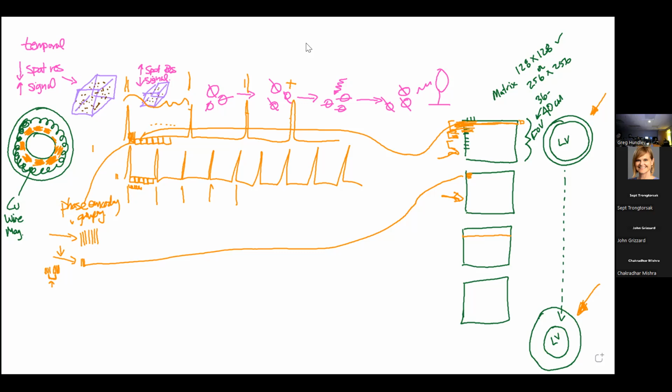Okay, so this is tachycardia. This is normal sinus rhythm. What have I got here? AFib, atrial fibrillation.